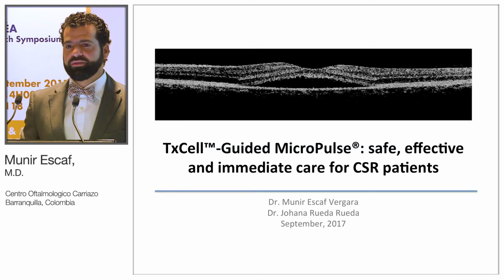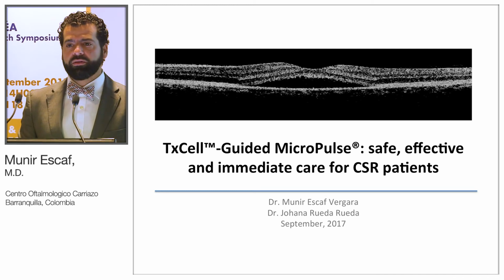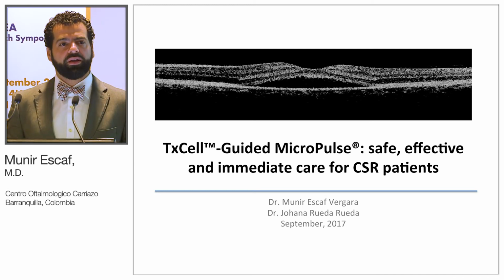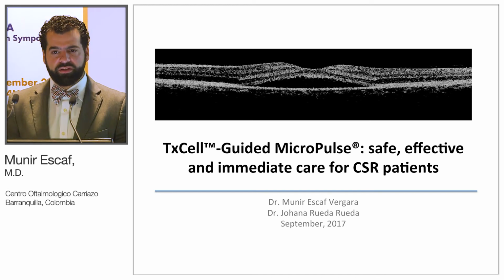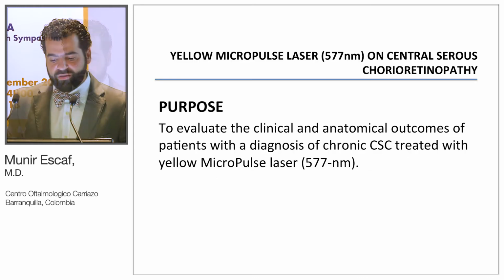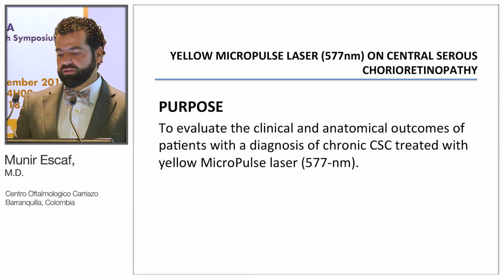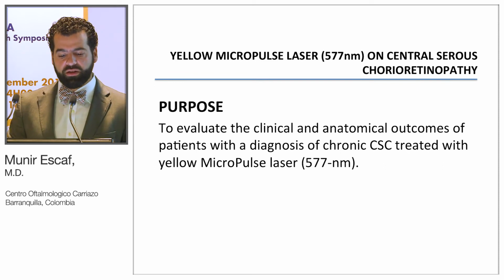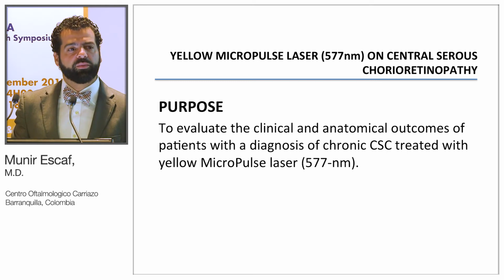Well, good morning, everyone. Thank you for being here. Okay, so I'm going to talk about a small work I did last year using my MicroPulse laser. Let's talk about TXCELL-guided MicroPulse laser as a safe, effective and immediate care for CSR patients. So the purpose of this work was to evaluate the clinical and anatomical outcomes of patients diagnosed with chronic CSR, treated with MicroPulse yellow laser.